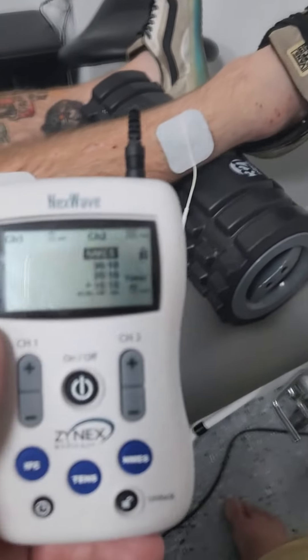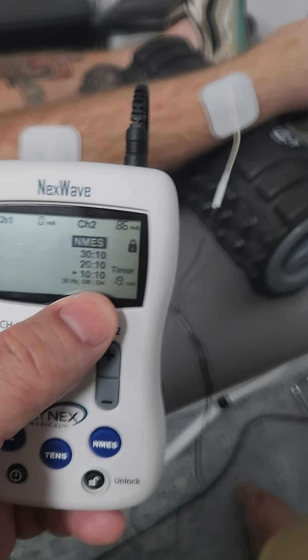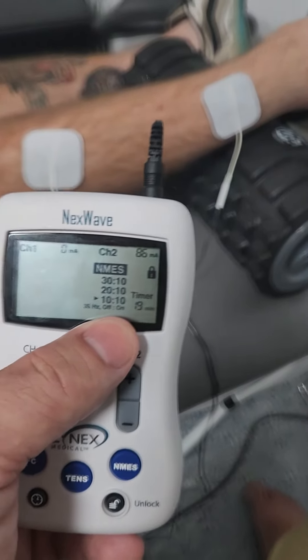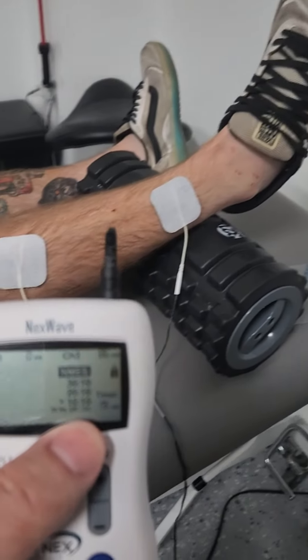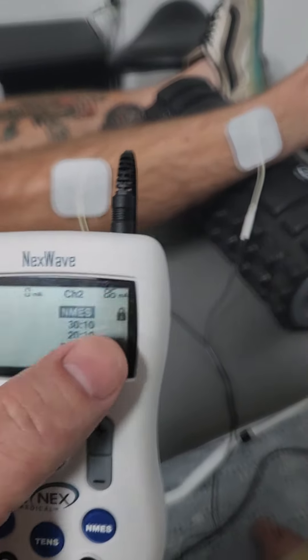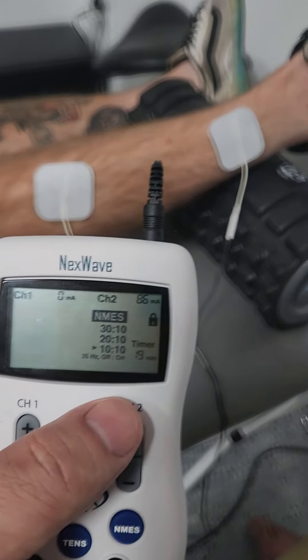You just turn on the neuromuscular setting, and I have it set for 10 seconds on, 10 seconds off, so you'll feel 10 seconds of contraction. With that contraction, I want you to lift your foot up as you're doing, then you'll feel 10 seconds off. You just turn up the intensity until you feel enough current that's going to assist you with the movement.